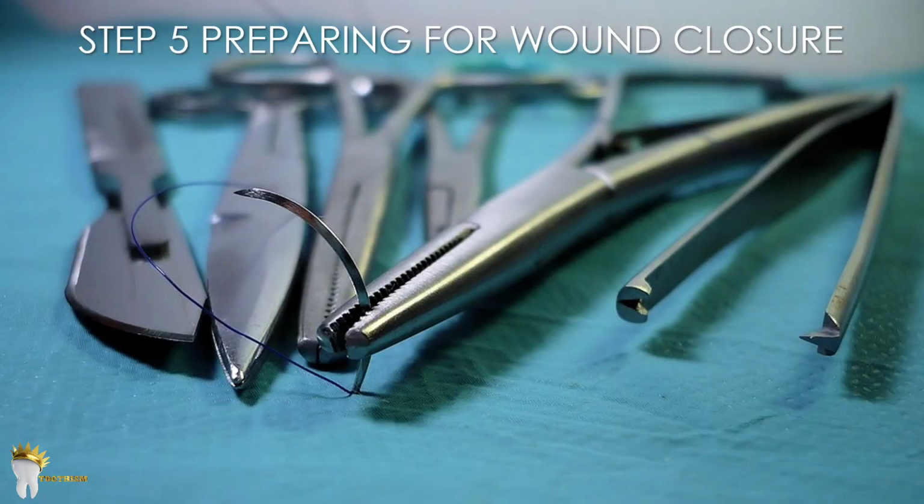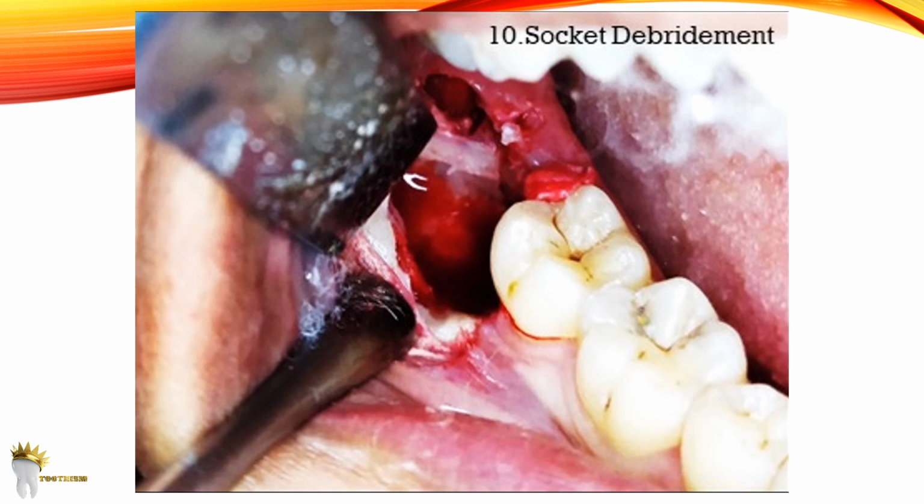Coming to step 5, which is preparing the wound for closure. This means socket debridement. In this step, we inspect the socket. If there are any sharp edges of the bone, it should be smoothened using a bone file. After tooth extraction, there are a lot of bone chips and debris in the socket. So these have to be removed by irrigation with sterile saline and suction.